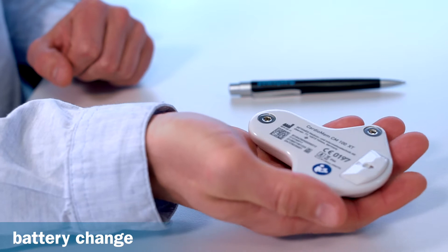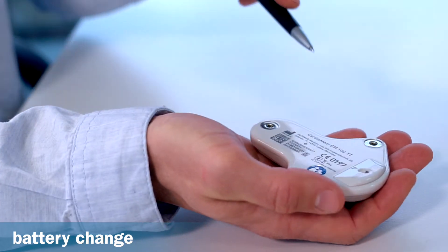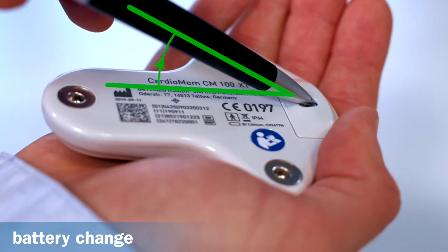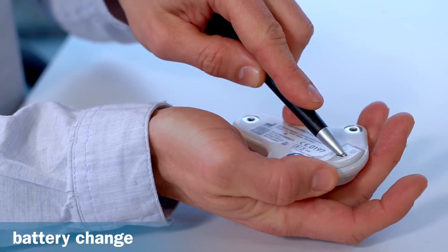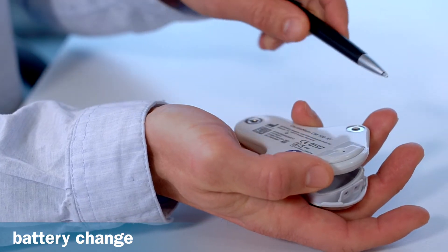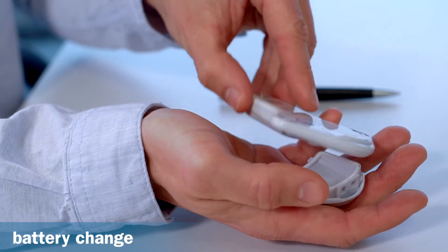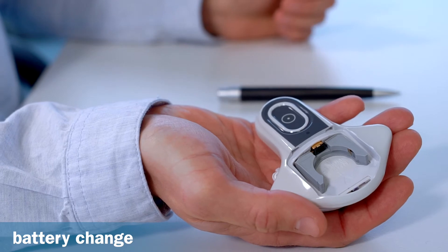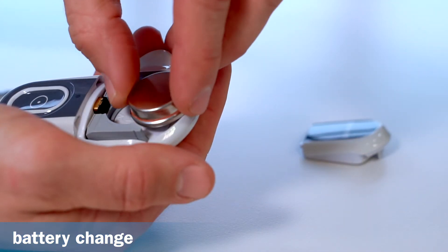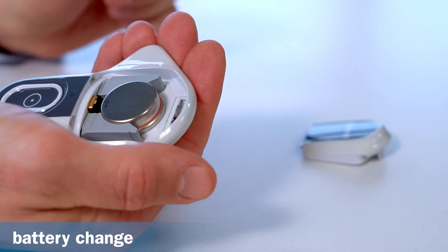Hold the recorder upside down securely in one hand. Use a ballpoint pen to open the battery cover by gently pushing the tip of the ballpoint pen into the hole until the lock releases. The battery compartment cover opens downwards and can be removed. By turning the device around, you can now see the round battery compartment into which you insert the battery with the printed side facing down until it audibly clicks into place.